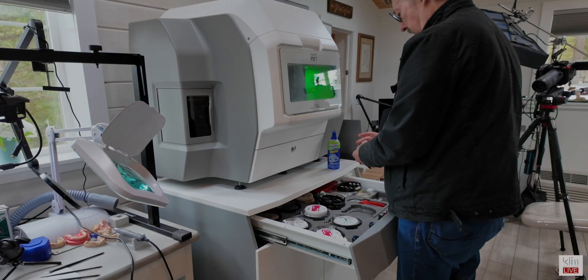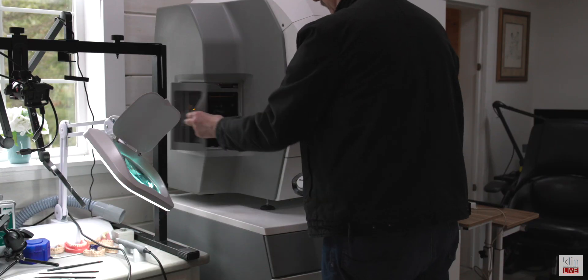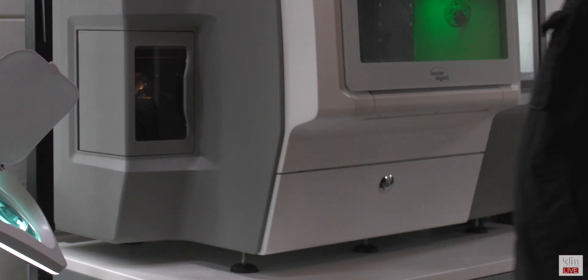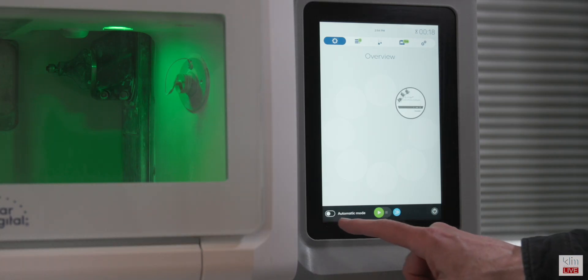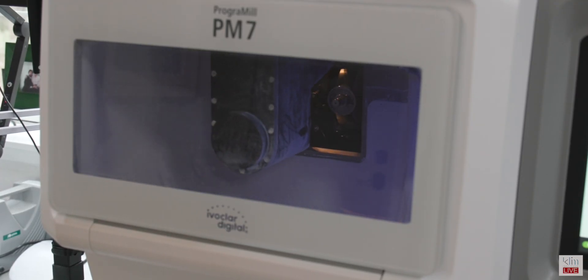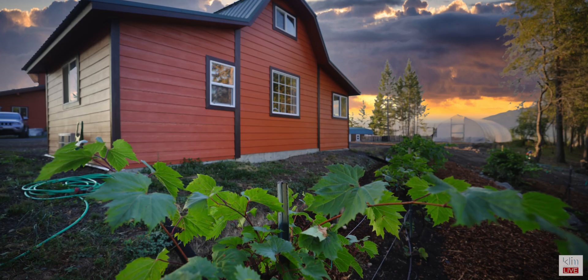Now we're ready to take the disk in disk holder and insert that into the material changer. The PM7 has eight slots, so you can do a lot of milling overnight. Once inserted, the RFID reader in the PM7 will read and register that disk, and then we're ready to start. Click on automatic mode and away we go with the milling. In this case, we milled out over 32 restorations overnight while I was sleeping at my homestead.